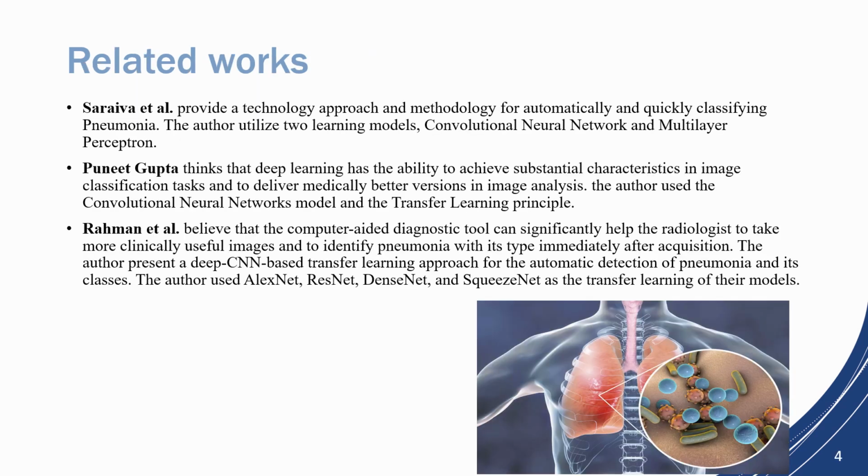Here are the related works that are already available and related to our project. Sarvai et al. provide a technology approach and methodology for automatically and quickly classifying pneumonia. The author utilized two learning models, convolutional neural network and multilayer perceptron.